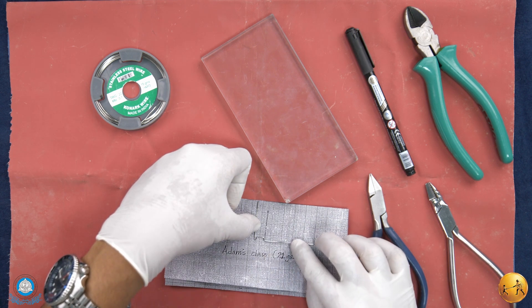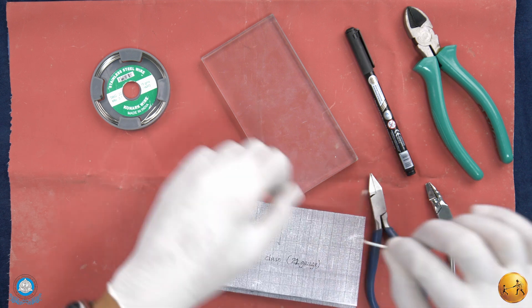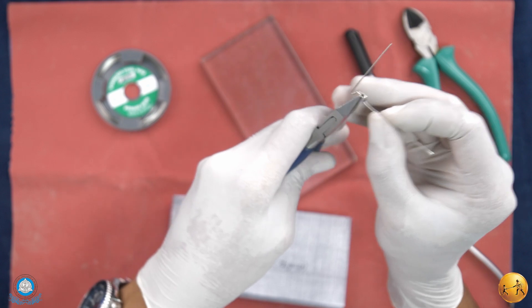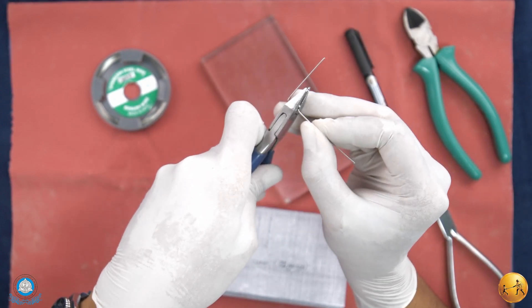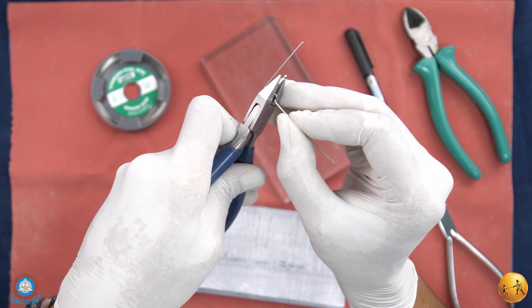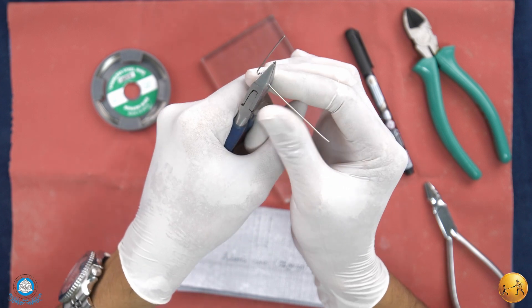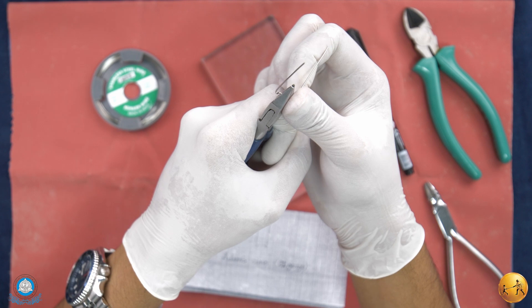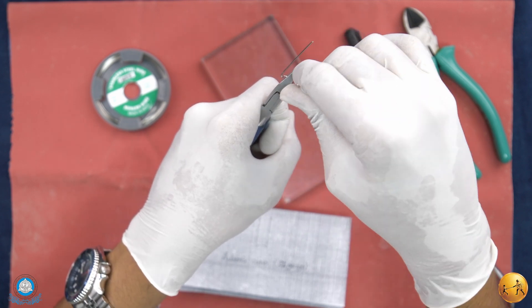The left side of the arrowhead is perfectly matching the outline. We will continue with the right side — again hold the wire at the edge of the plier, grip it properly with your thumb, apply a downward pressure keeping the pressure constant, and then just lift the wire upwards.